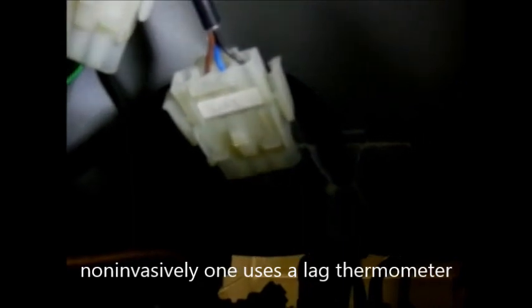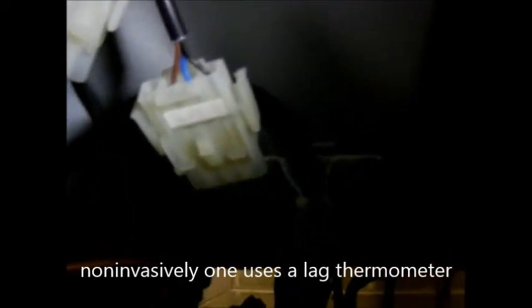RTD probe. RTD probe is a temperature sensor that measures the temperature related to the amount of resistance felt on the sensor. A technician can insert an electronic thermometer into the port to measure the temperature inside the chamber. Or they can use a digital multimeter to measure the resistance and convert resistance to temperature.